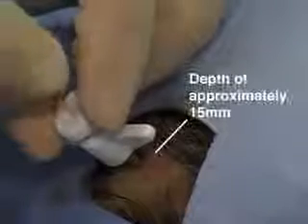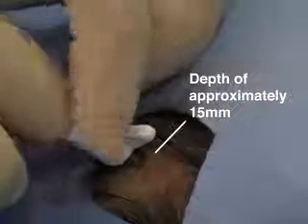Insert the ICP sensor through the bolt to the desired depth, which is often approximately 15mm into the cranium, and then secure the sensor in the bolt by turning the adapter clockwise. When a strain gauge is used, a bend may be placed in the sensor at the desired depth, but other types of sensors should not be kinked.